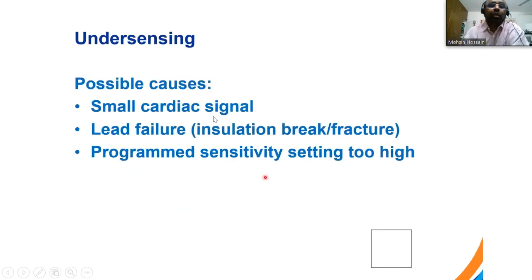Possible causes are a small cardiac signal, lead failure, insulation break or fracture, and programming sensitivity set too high. That is, the sensitivity number is very high. If you set the sensitivity number high, it can undersense. The sensitivity setting being high is a possible cause of undersensing.